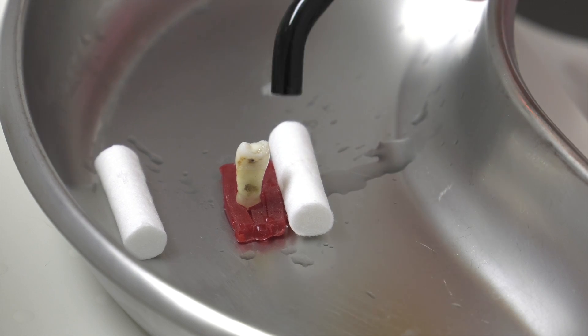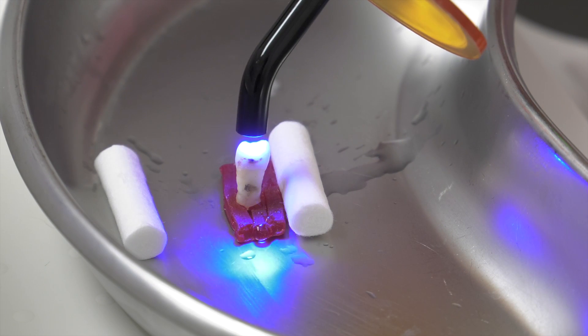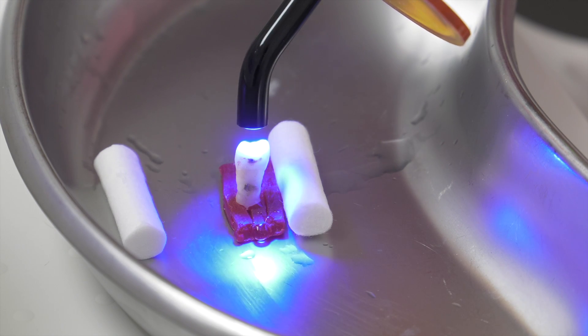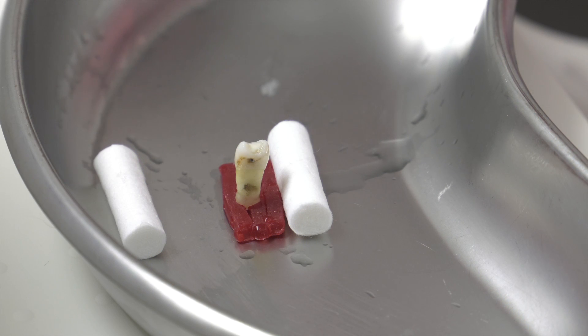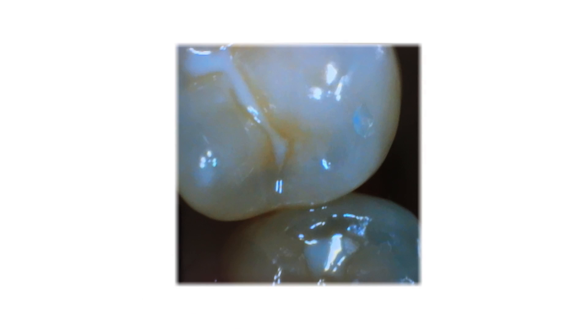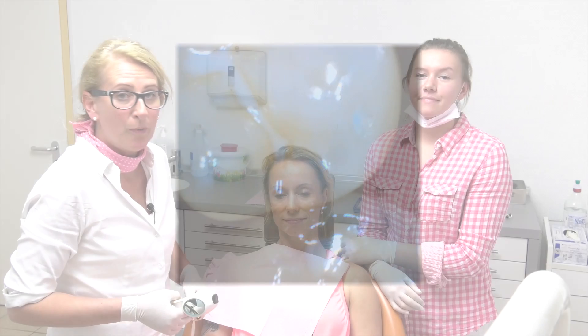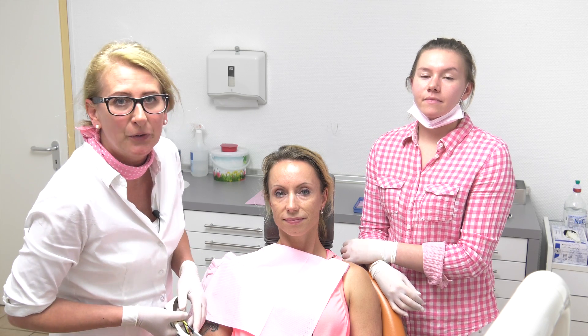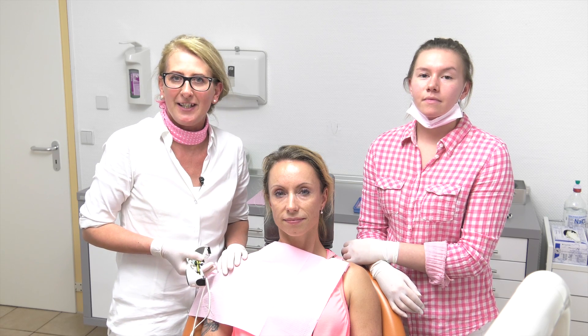And dry it with the light. So you were able to see the ordinary treatment. I hope I could inspire you for the laser treatment — you reach the same aim, but the treatments are totally different. You can see in the picture the excellent result: the surface is shining, we have a very good bond, and the patient feels good. The results are excellent. Next time I show you how to clean teeth by using the laser. See you.